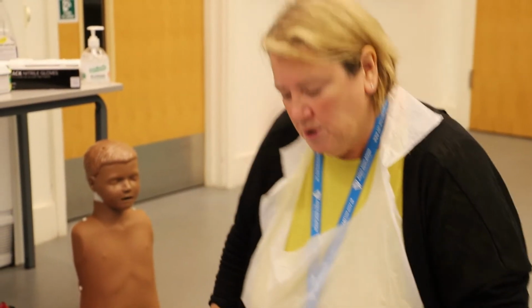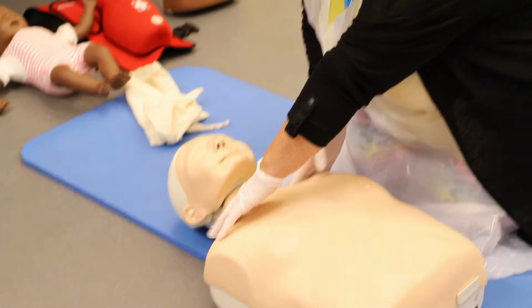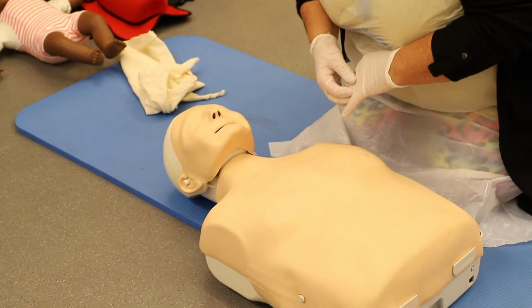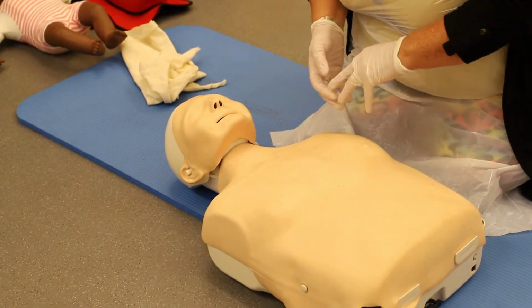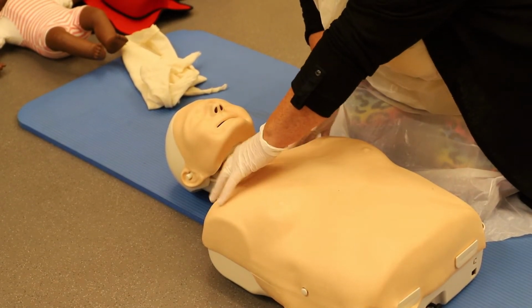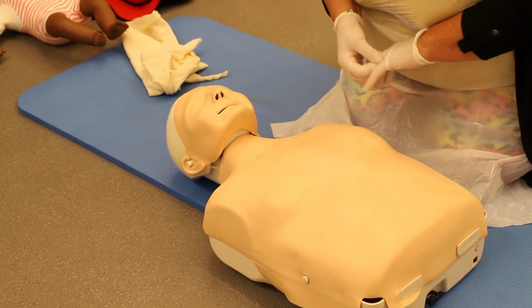Okay, so now we need to check for the R, which is response. We'll tap our casualty on the shoulders and speak to him at the same time. Hello, can you hear me? The reason we do this is in case our casualty is deaf, and we're hoping that we will get a response from him by touching him and talking to him at the same time.